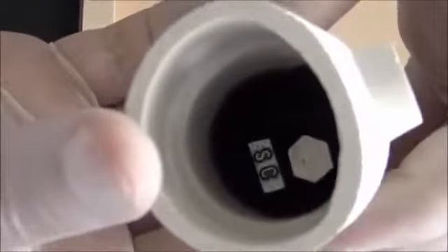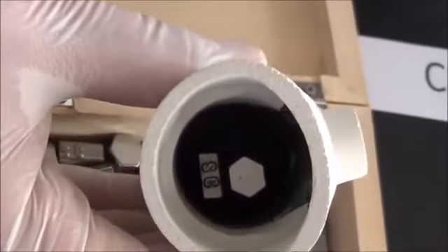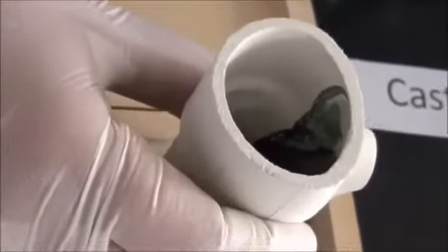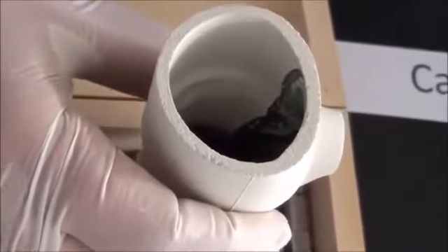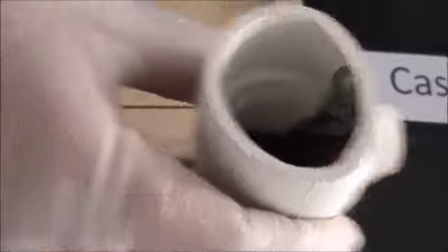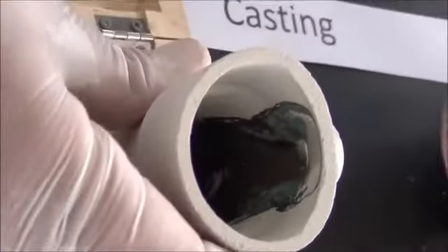If you look inside, as you see, this crucible has the metal still solid. Once heated to the temperature specific for chrome cobalt melting, it becomes liquid, and a process of centrifugation, fast rotation, will take this liquid out from inside the crucible. You could follow the green color inside.